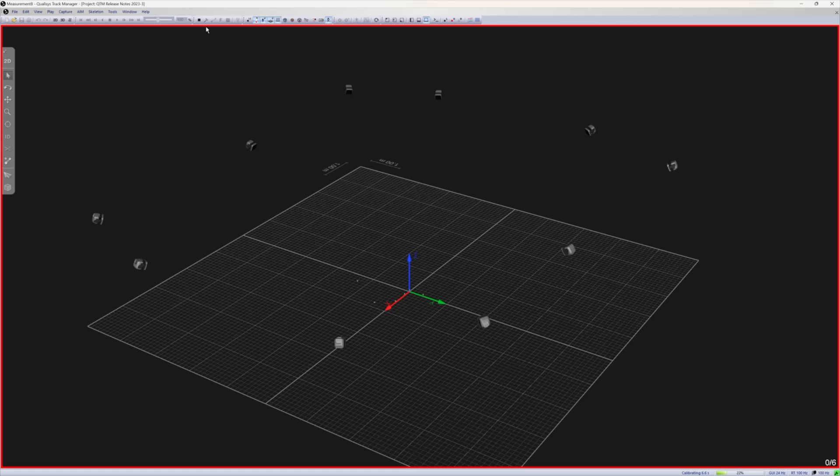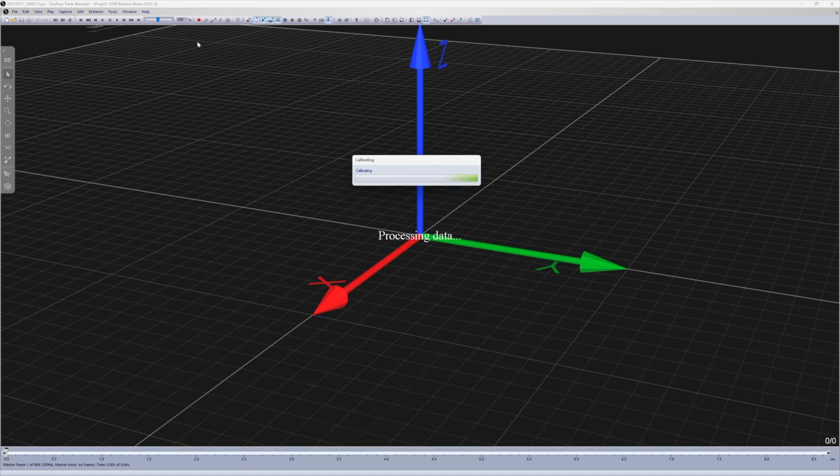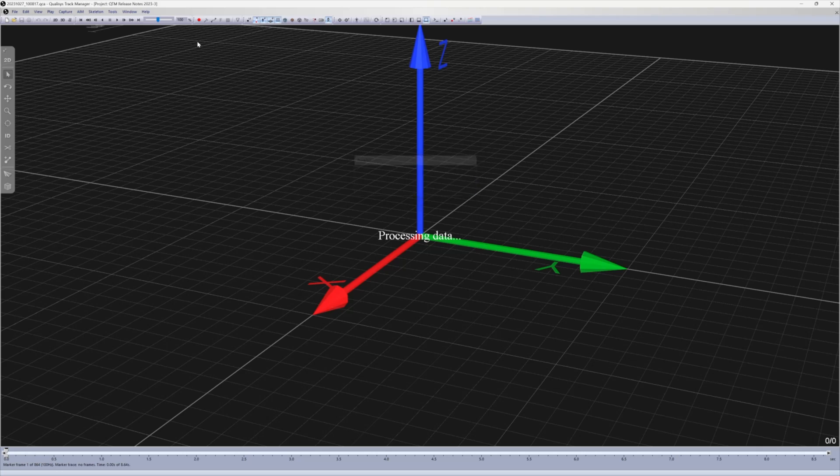When calibrating your Qualisys system, you can now stop calibrations before the specified time is up.